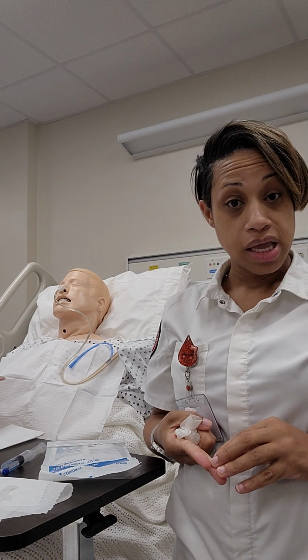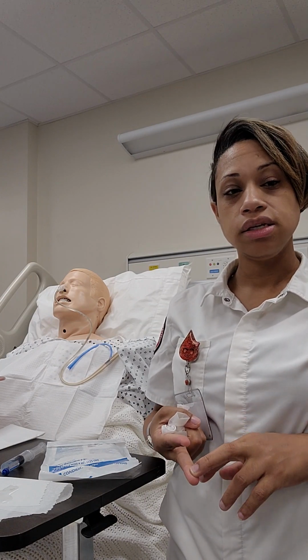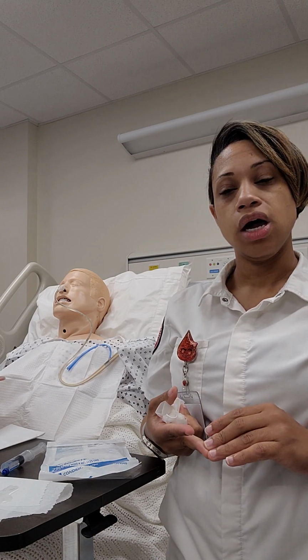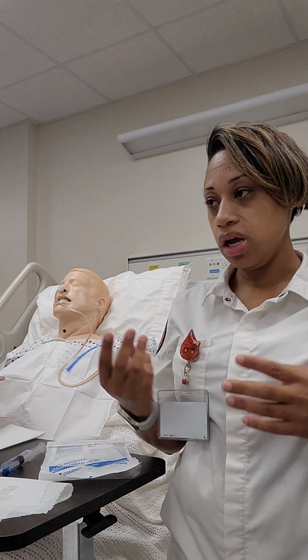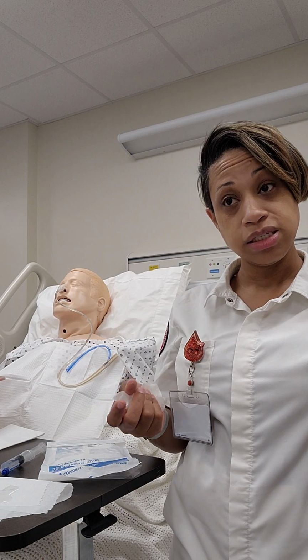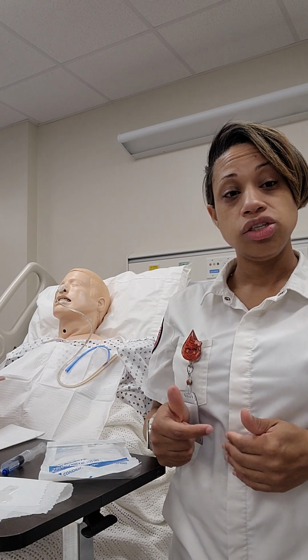I will document. I will document the size and the type of tubing I use. I will document which naris I use, description of any gastric contents that were seen during the placement, and then the patient's tolerance.